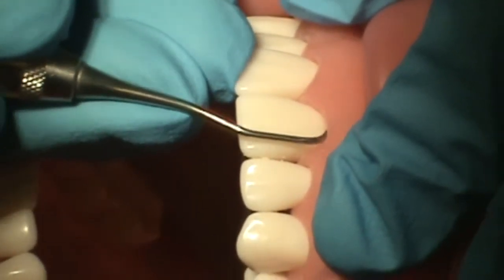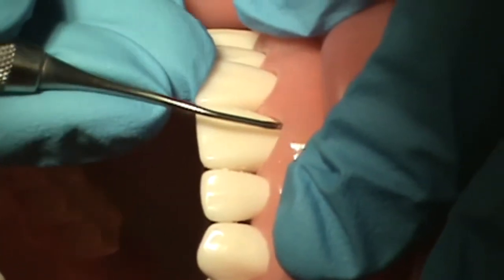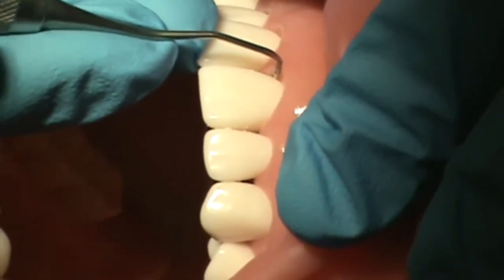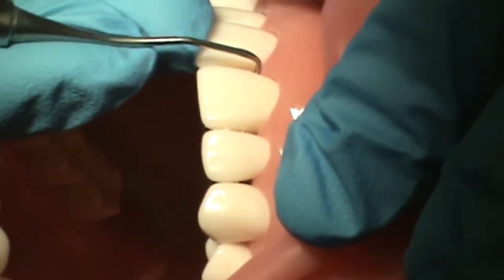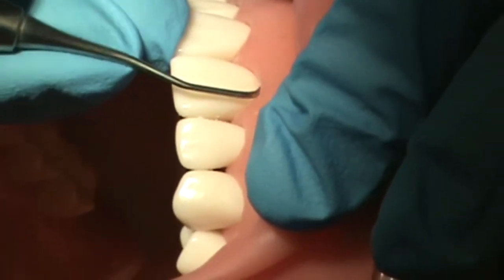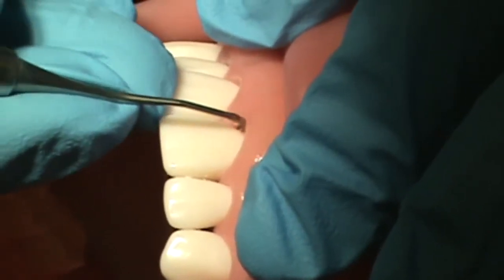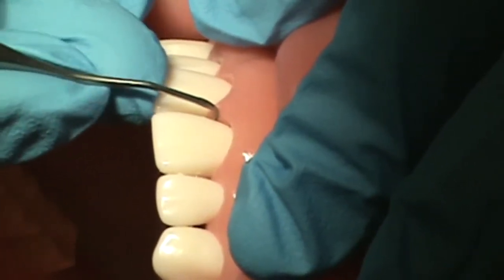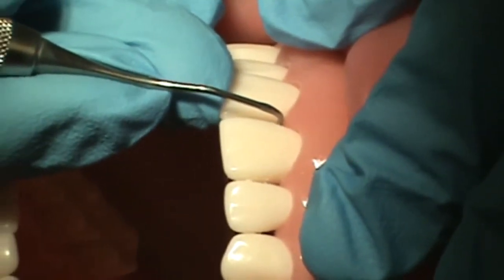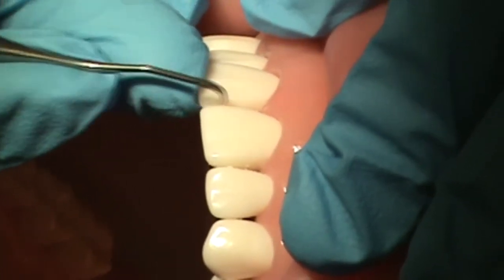Her initial stroke is in a coronal direction and she will use short, controlled, overlapping strokes along the root, never removing the instrument from the pocket, but keeping the cutting edge in contact with the tooth at all times. She rolls the handle along the mesial facial line angle as she root planes along the facial towards the mesial, utilizing a wrist rock technique instead of finger motion. She will root plane into the interproximal and under the mesial contact, applying appropriate lateral pressure the whole time.